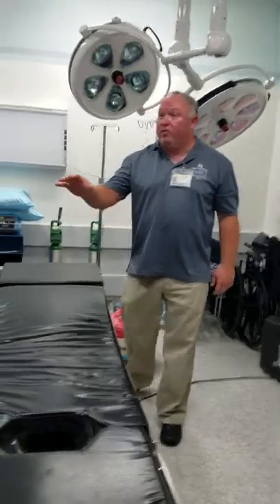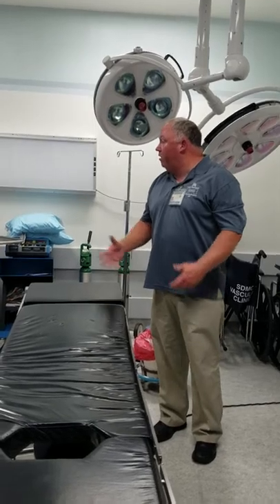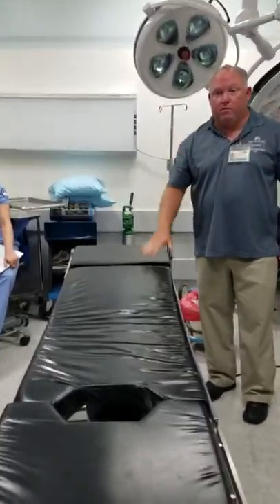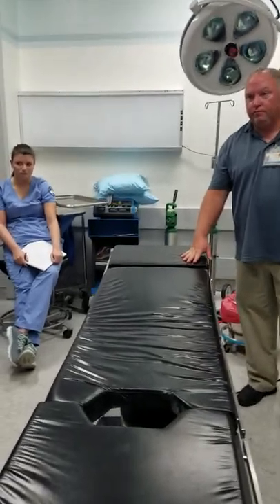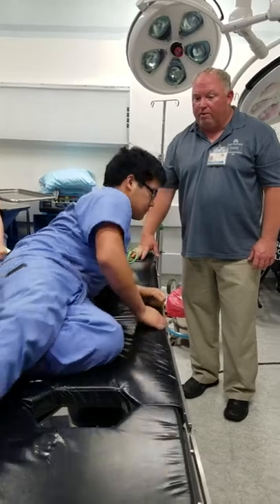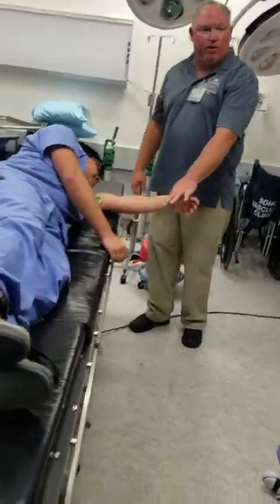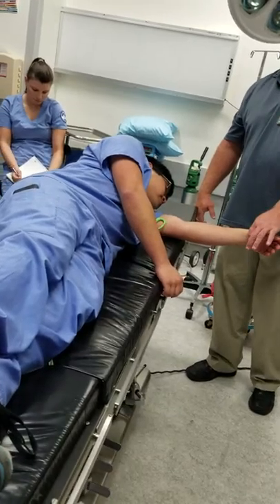So again, the patient gets their spinal. They're supine, then they get the Foley. Now the patient goes lateral. We need a participant for the demo. Either side — it doesn't make a difference. What hip would you want operated on? Okay, this arm is going to come out. I don't see the armboard in the room, which is where you usually have one — there should be one right here.